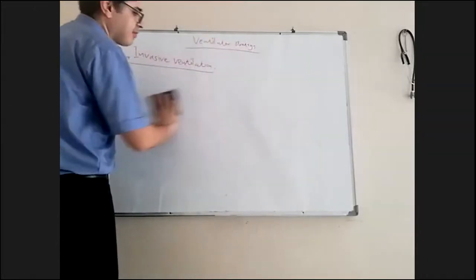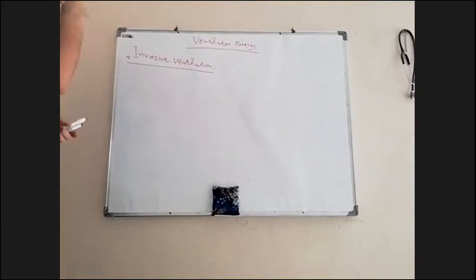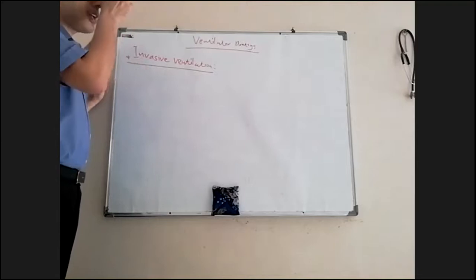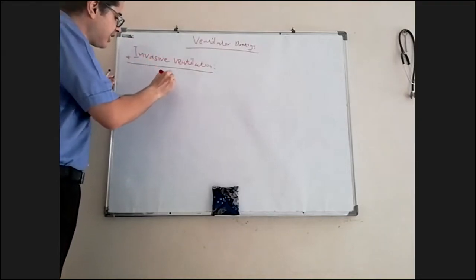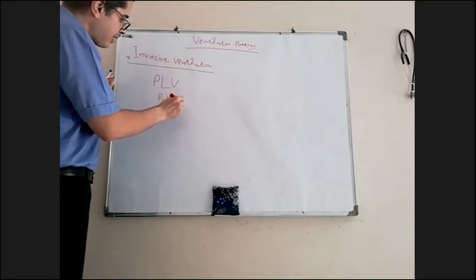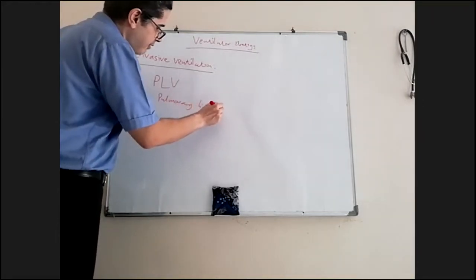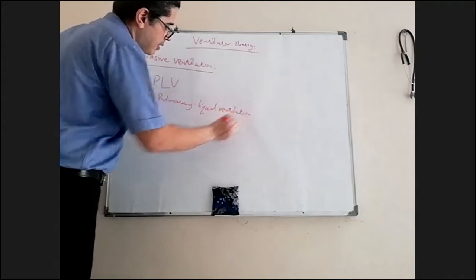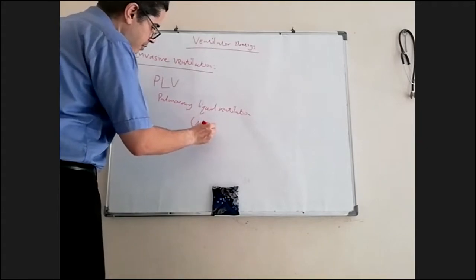Another thing I never saw in my life, and never heard about until recently. It is called pulmonary liquid ventilation, PLV. This one is not approved yet, still not approved.